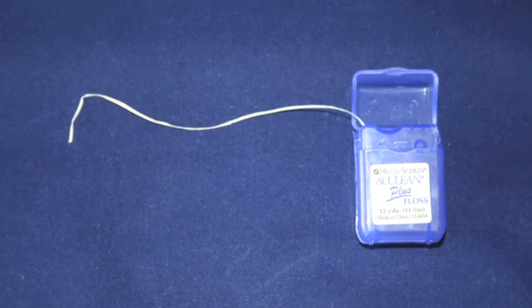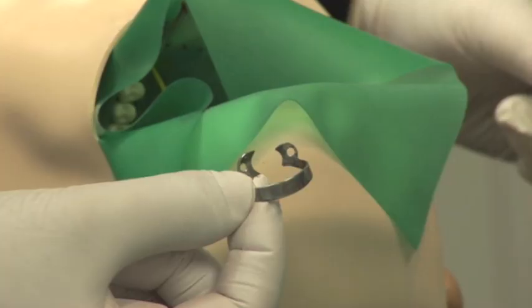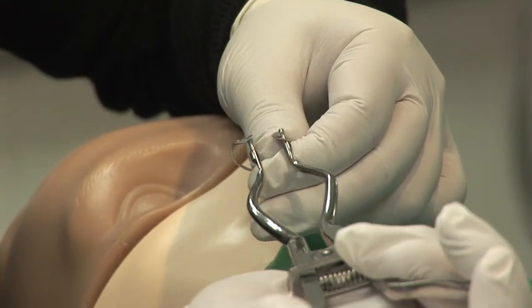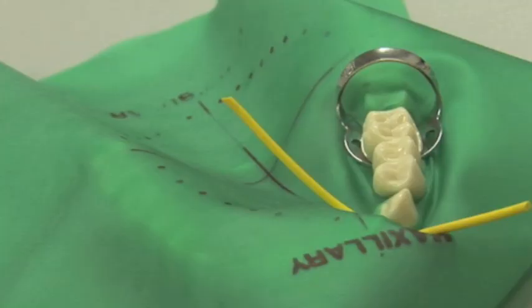Stretch out the holes and push the teeth through the holes. Use the dental floss to push the dam below the contact. Use the wedget to stabilize the rubber dam. The arm of the clamp should be facing posteriorly.